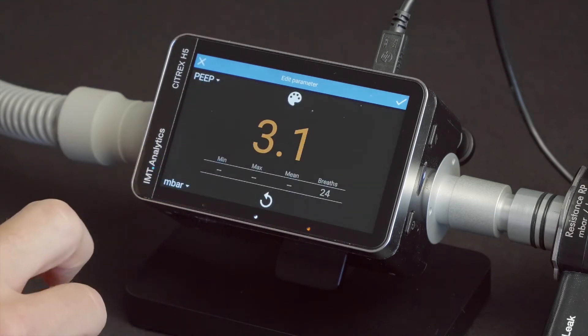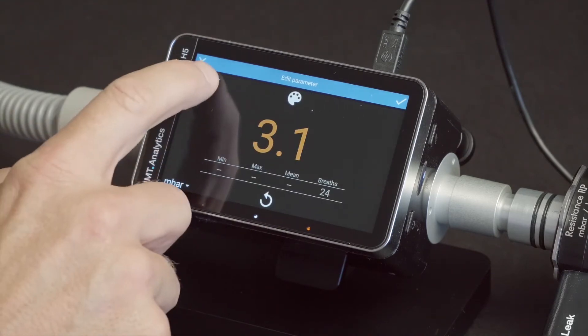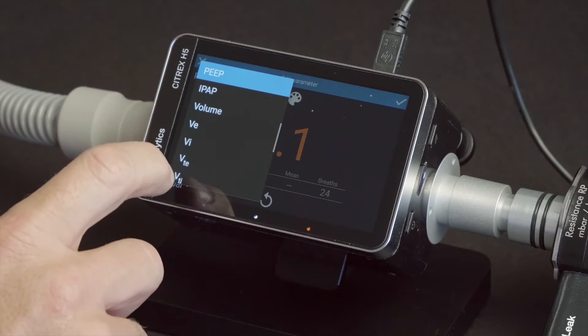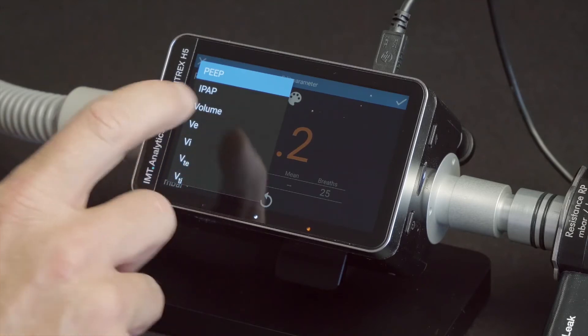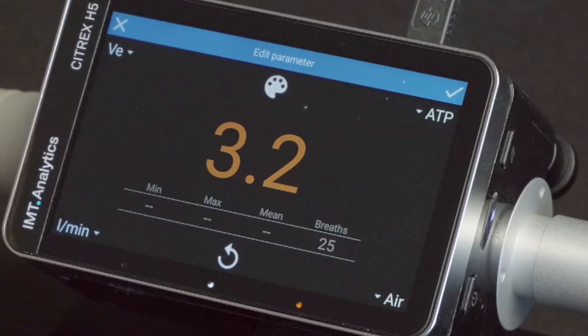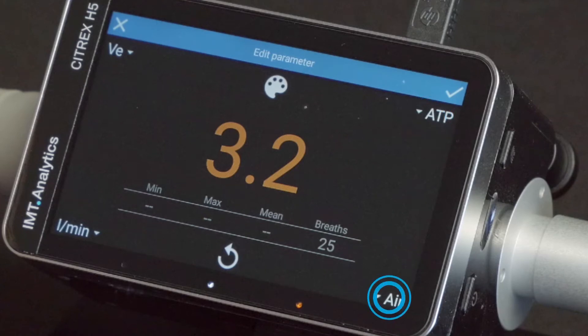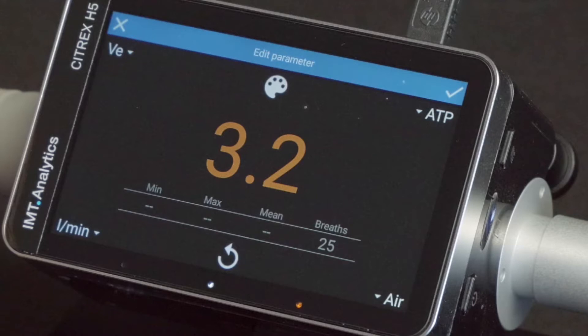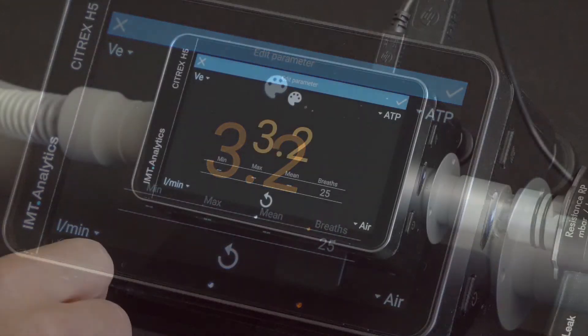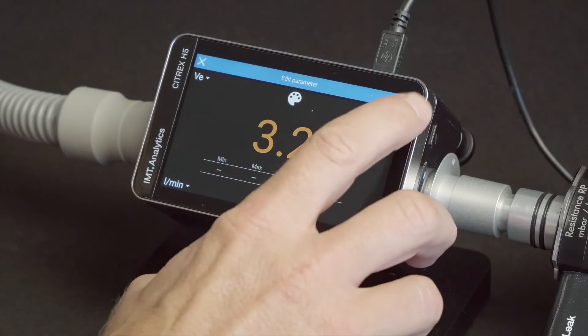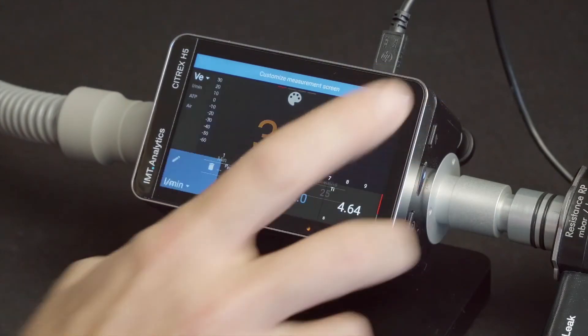To change a value, tap on the element once. Edit all your preferred parameters. In the right corner, you can change the gas standard. In the corner right below gas types, left corner measurement parameters, and left down below the units of measurements. Confirm it by the tick. That's it.